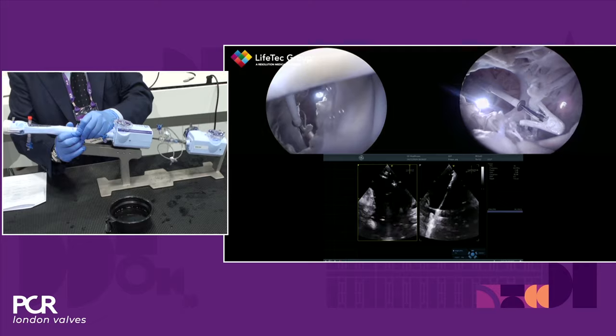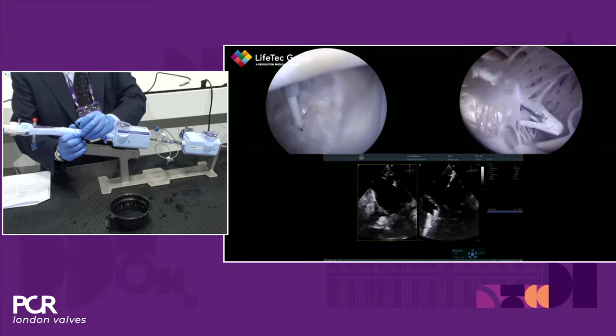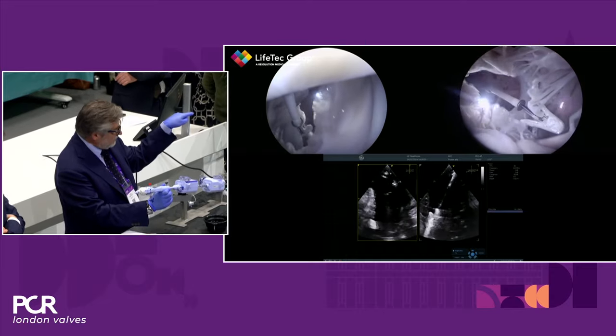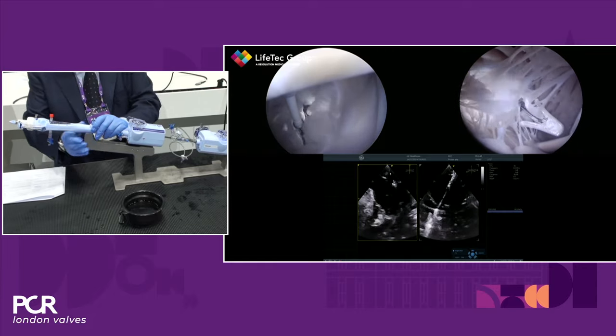By the way, on the right side picture, which is anterior, which is posterior? Is it like a transgastric view? Anterior is on top in that video. On the camera? It's like transgastric. So on top we have posterior then. Yes, on the right we have the septal and on the left we have the anterior. Perfect. So it's like a transgastric view.